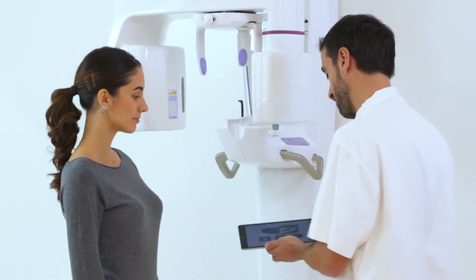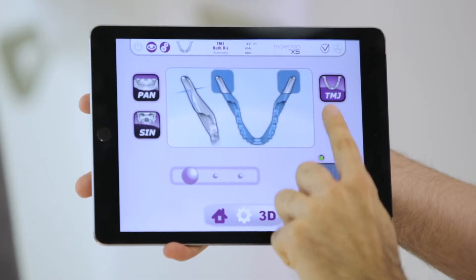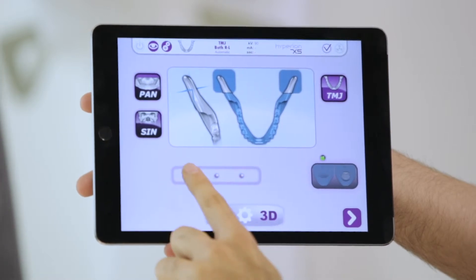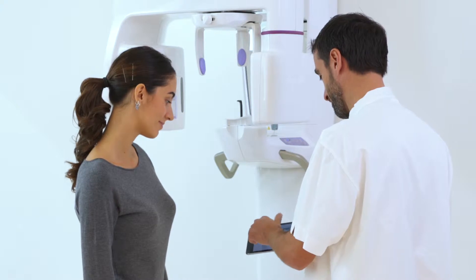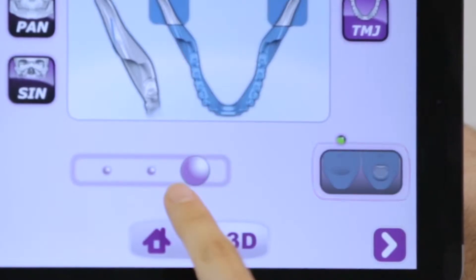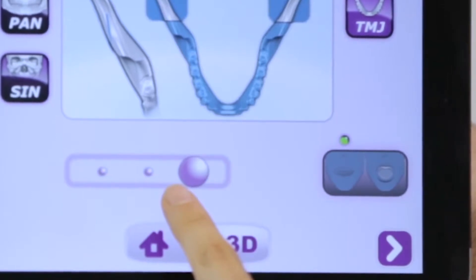To perform a temporomandibular joint scan, the dentist chooses TMJ from the projection icons displayed on the iPad. Then, scrolling through the function bar, he can select one of three types of projection. These tests can be performed with an open or closed mouth by selecting the corresponding icon.